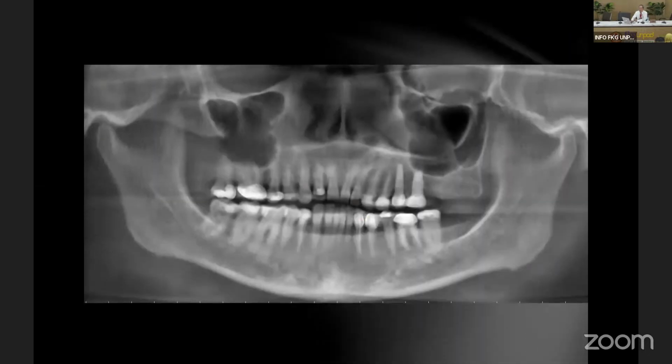This is a patient with an implant placed outside the dental office. But the patient felt discomfort after the implant was placed. Looking at the panoramic radiograph, it looks not bad. Actually, the implant looks like it is right in the sinus area.